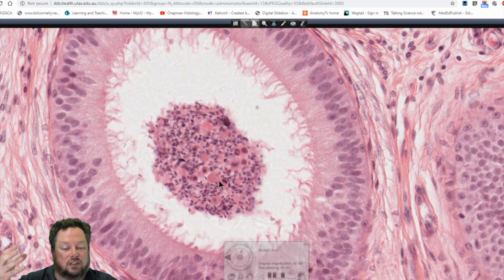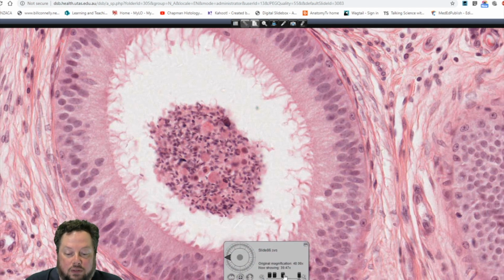That becomes known as a residual body, and sometimes that's shed early and the nurse cells phagocytose it, but sometimes it's not shed until a little bit later during transit through the epididymis. And so sometimes you may have these round spheres of cytoplasm that are the residual bodies of those sperm, continuing and finishing that spermatogenesis process.